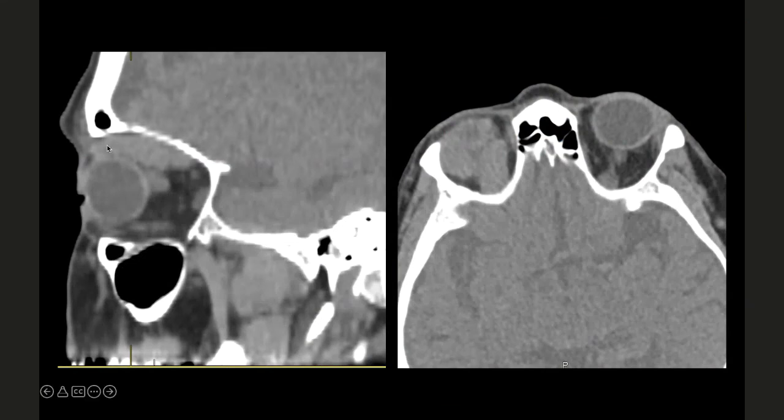So see this, it looks big. It should be bad and ugly, but it's not. It's like kind of a gentleman. So you can see the mass. All this is extra stuff. Anything extra, I'm going to call it. But it's getting close to the globe.